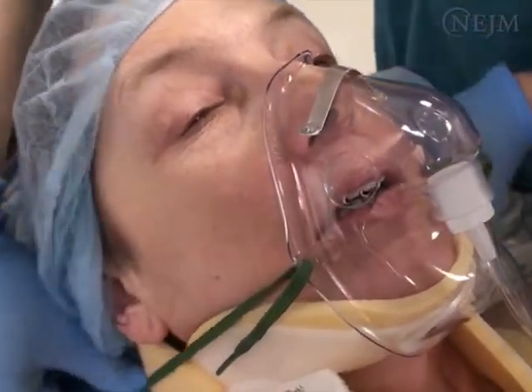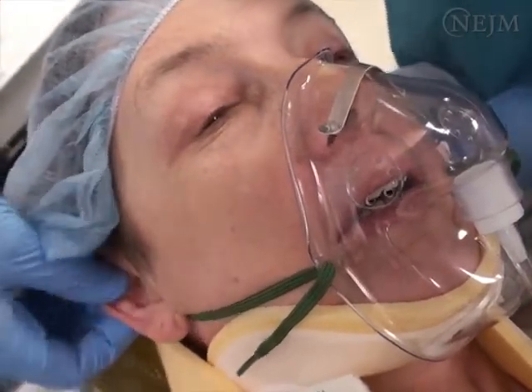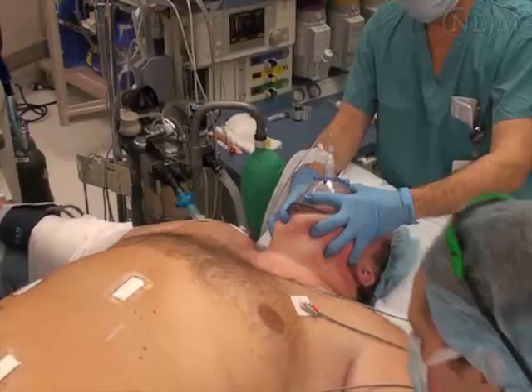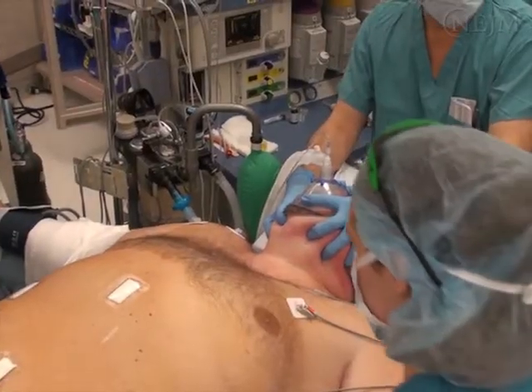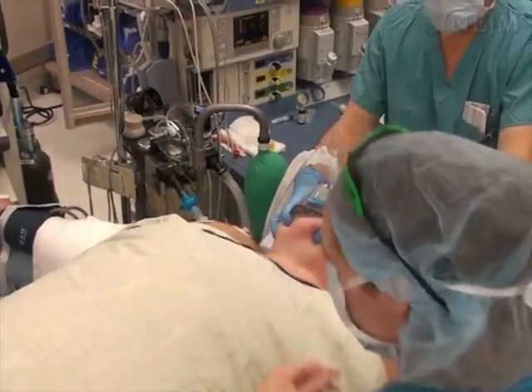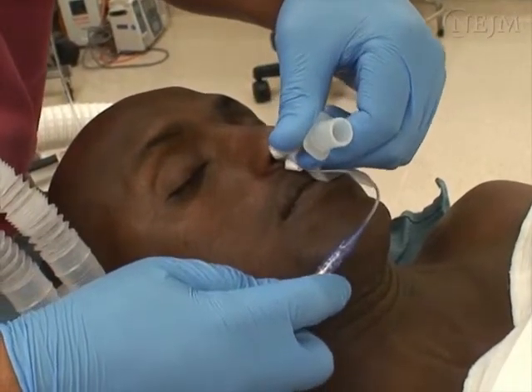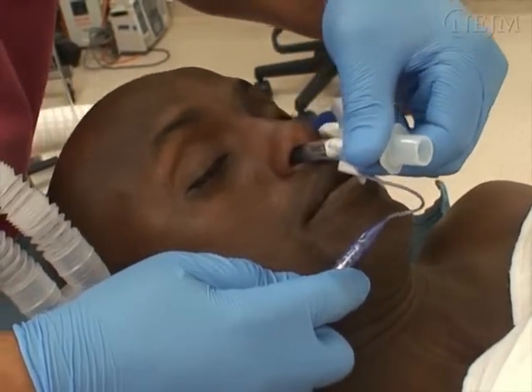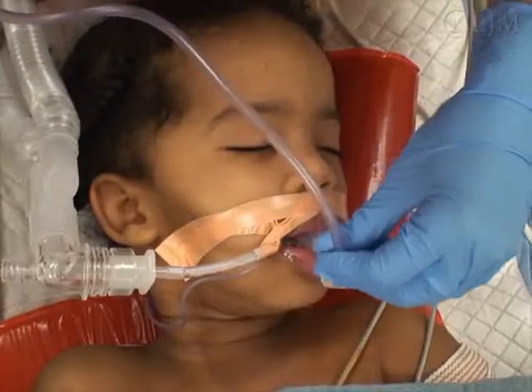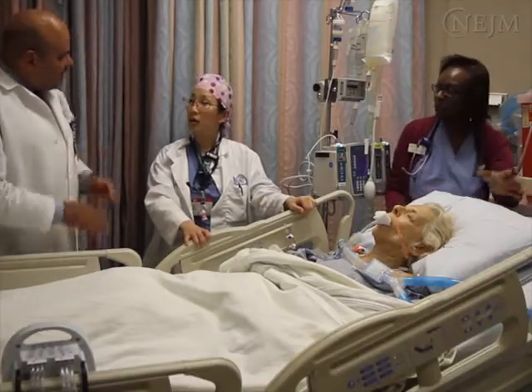Continue to provide supplemental oxygen through the face mask until the patient has fully recovered. In the next segments of the video, we will limit our discussion to extubation of morbidly obese patients and difficult extubation. There are many other clinical situations in which endotracheal extubation can take place that are not discussed here — for example, nasal extubation, pediatric extubation, and extubation following prolonged intubation.